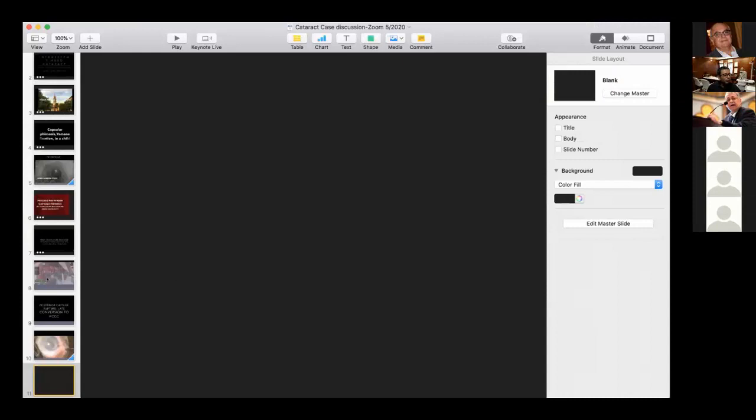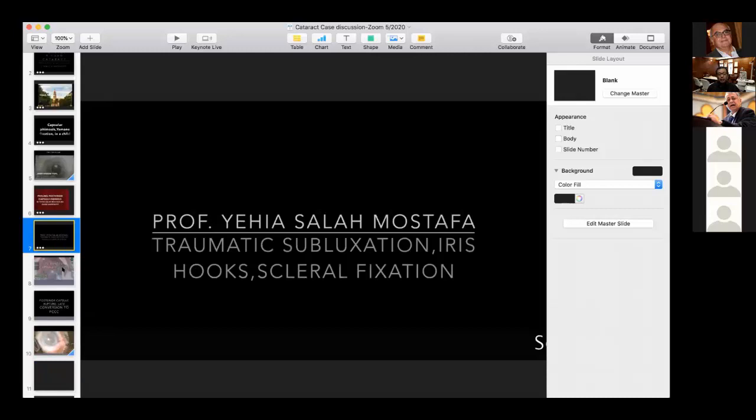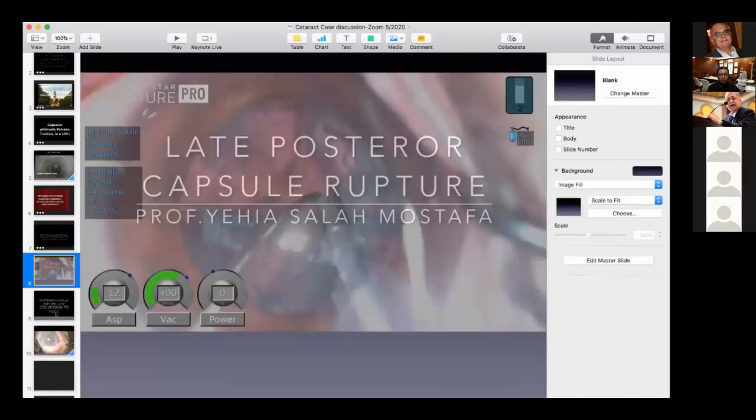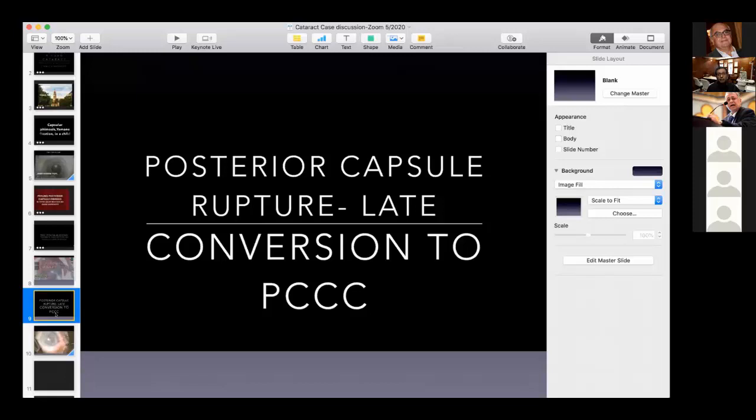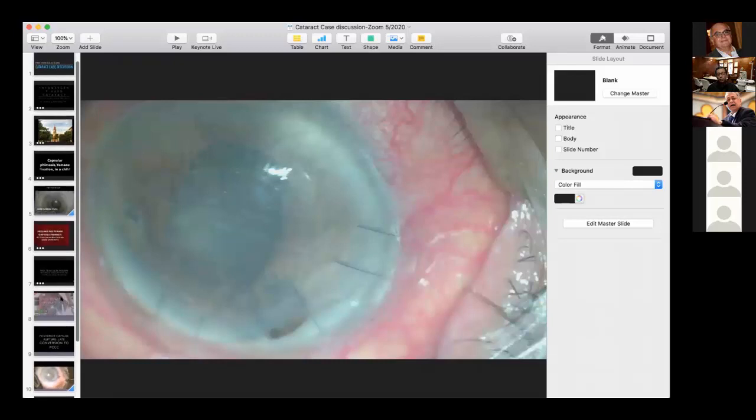Okay. One person was asking about the case I presented. He was asking if I inject viscoelastic and prolapse the nucleus to the anterior chamber. Well, why would I want to prolapse the nucleus into the anterior chamber and emulsify it there when, as you can see, it's a Morgagnian cataract? It means that this is an old person, it means that his endothelium is definitely not the healthiest. I don't want to, and it's a brown nucleus. It's not an easy procedure. So I don't want to emulsify next to the cornea. I want to stay away from the cornea as much as possible.